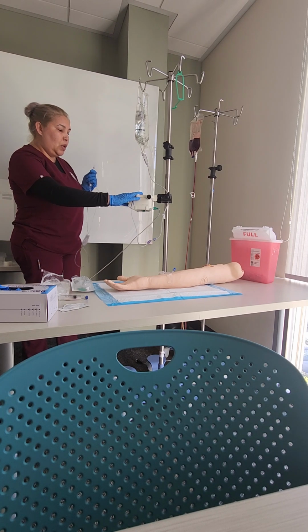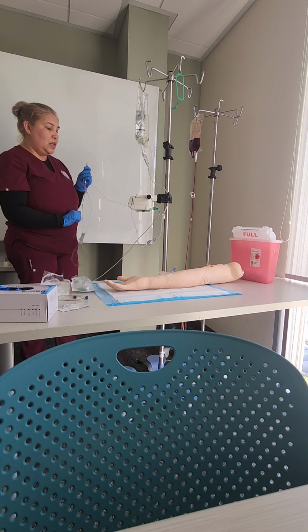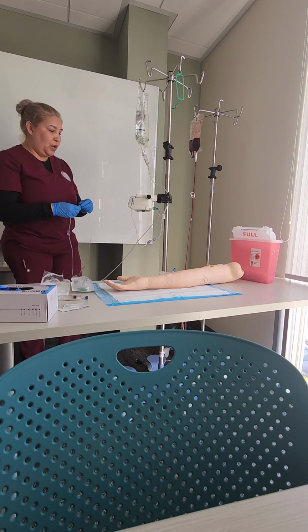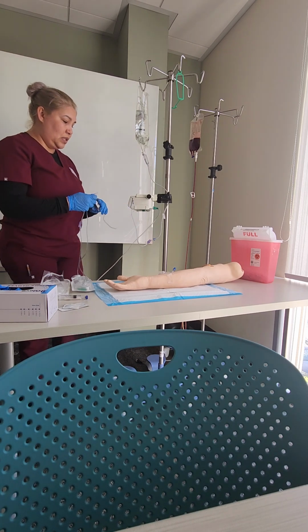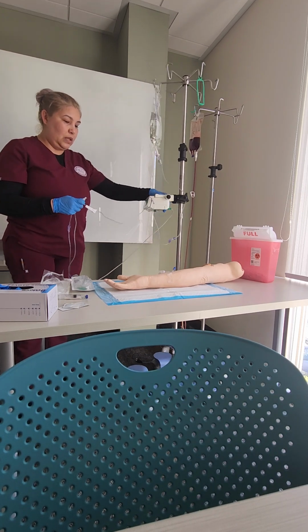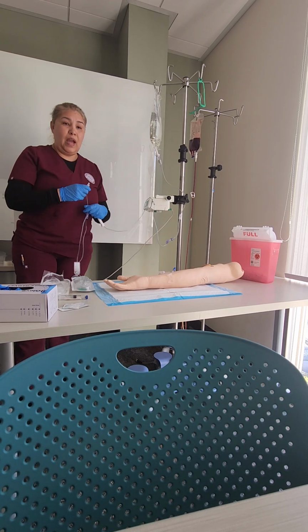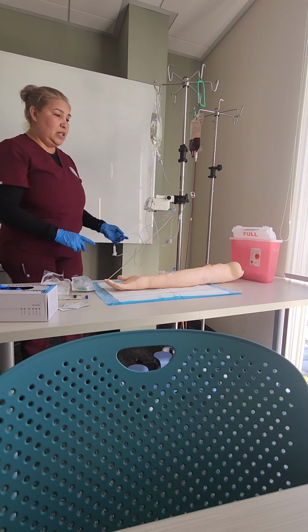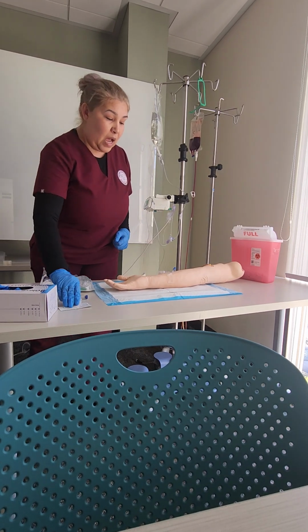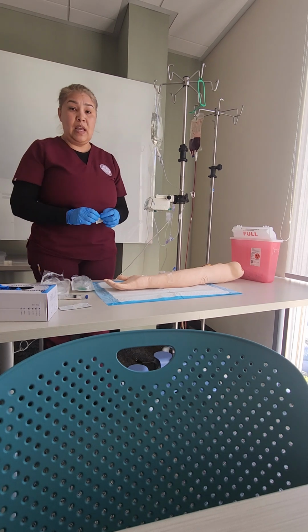Okay, so I'm going to confirm it's going at a rate of 75 mLs. My volume to be infused is 900. This is perfect. What I'm going to do now, since I have already assessed my patient, is make sure that I flush my patient's IV, because I inserted this IV early in the morning. However, it definitely could go bad between the time I've inserted the IV and now.